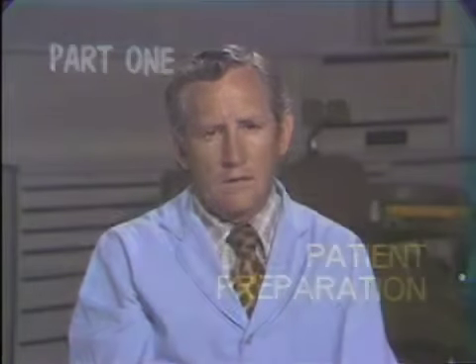The first phase of establishing a stable base is to record a stable impression. The purpose of the impression is to fit the base to the patient's individual and peculiar ridge form. Our objective then is to record the tissue in a healthy condition and in a semi-dried state. The first phase in preparing the patient is to allow the tissues to assume a normal, healthy condition.